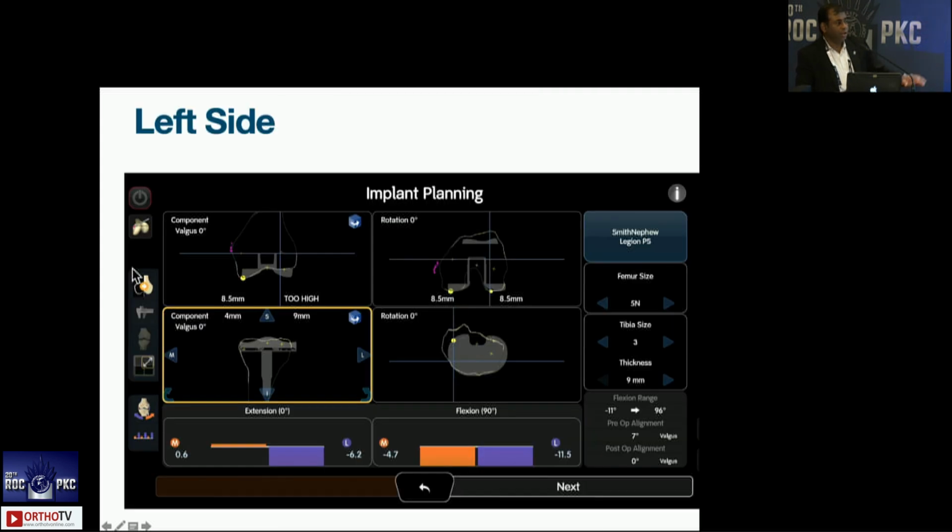Again, much more challenging. You have got a tight flexion gap. So again, when you look at balancing, you have to look at 4 corners: posteromedial, posterolateral, anteromedial, anterolateral. So here, if you look, both of these are quite tight. Anyone who wants to take, we have time here, so we can ask the question: what will you do? What will any of the conventional or navigation or even conventional instruments people will do? If you get this kind of graph, what can be done?